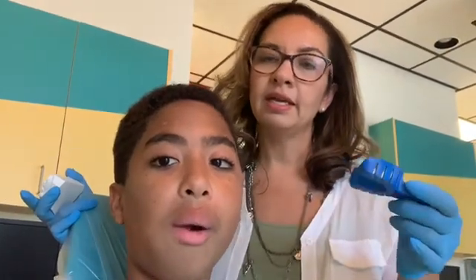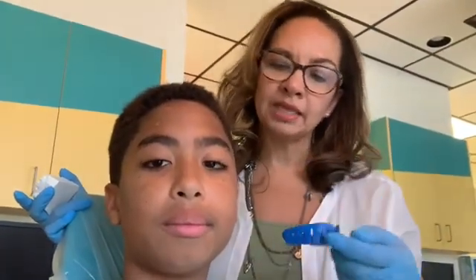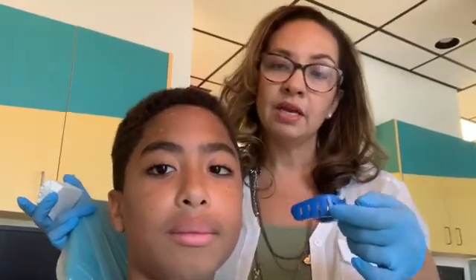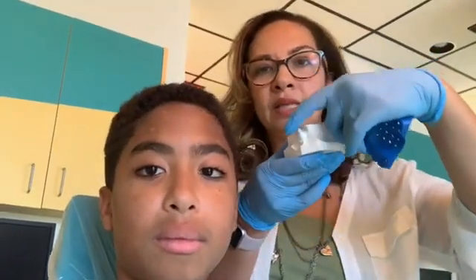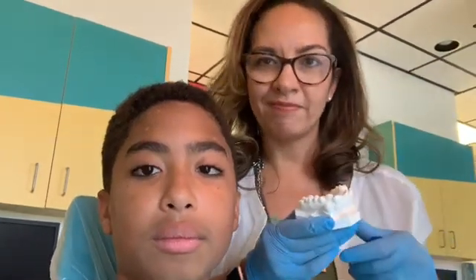Many of you know about dental impressions — you may have had one at the orthodontist when getting braces. The dentist or dental assistant will have some trays to try on, and once we take the impression we're impressing the teeth to get a mold of them. We send it to the lab, the lab pours it up in plaster to get a model of the teeth. At the lab they have a vacuum machine that melts some rubber plastic and sucks it down to conform exactly to all the teeth, giving that custom fit.